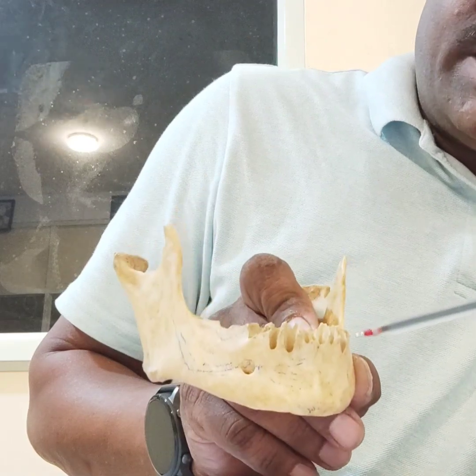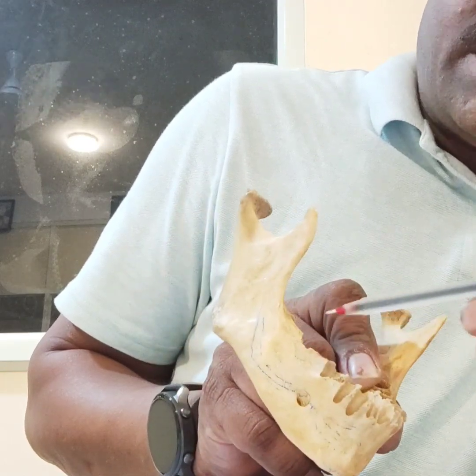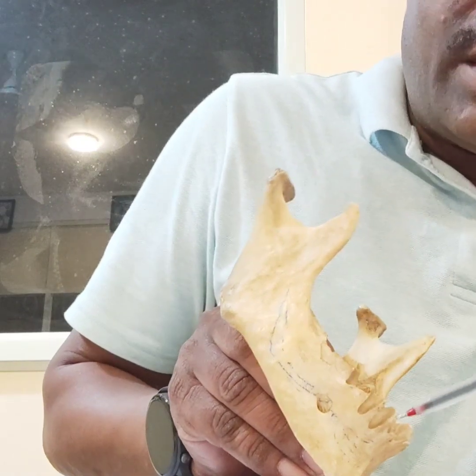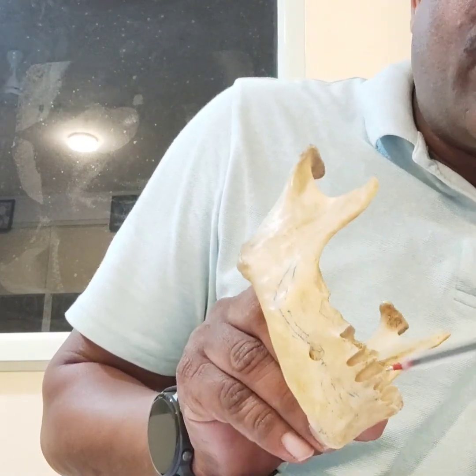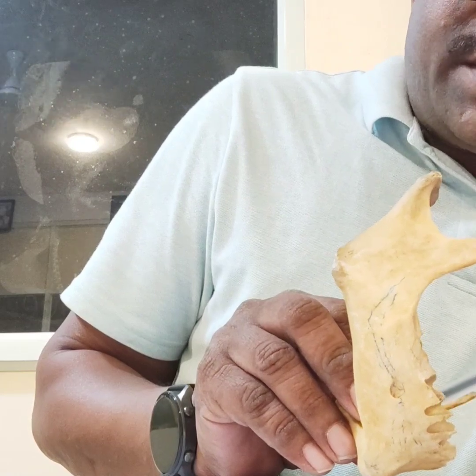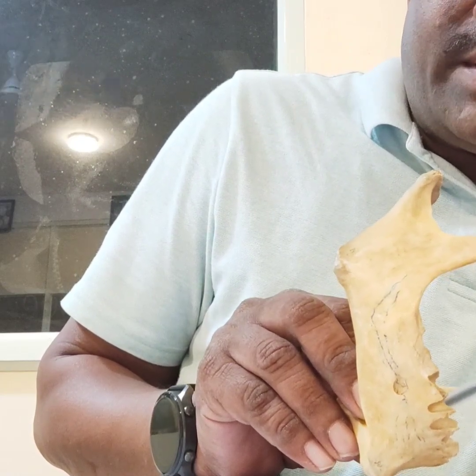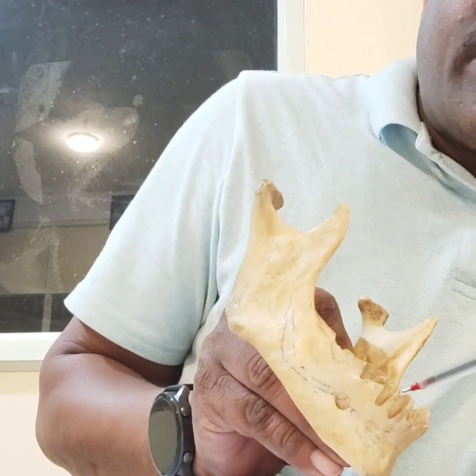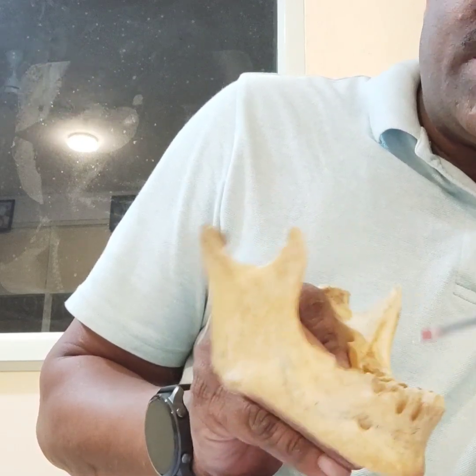And while placing the implant in the molar area, if there is atrophy, you have to angulate the implant. How are we going to angulate the implant? You have to angulate from buccal to lingual. That we call the nerve bypass technique. So we are going to engage the implant in the mylohyoid ridge, the mylohyoid bone. We are going to engage the implant in the inferior quarter of the mylohyoid bone, that is the D2 bone. And then you can bend the implant for the occlusion. That can be done on both the sides.